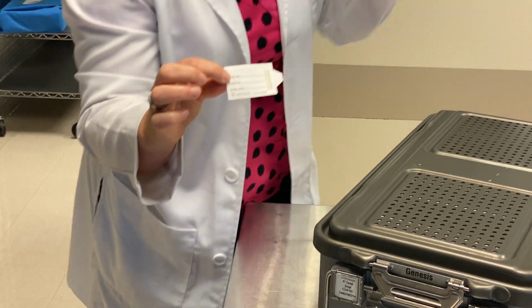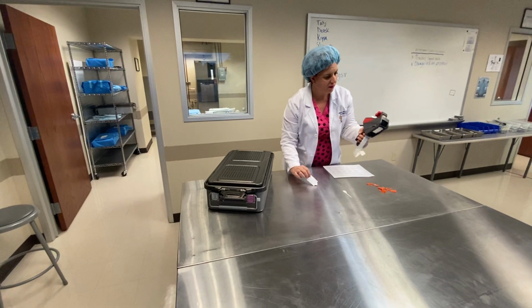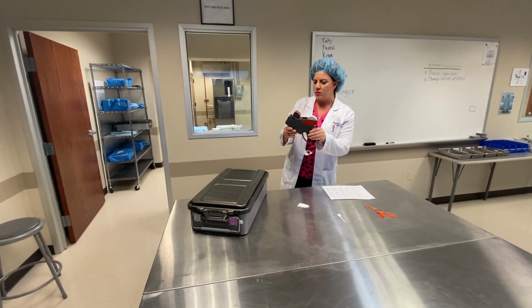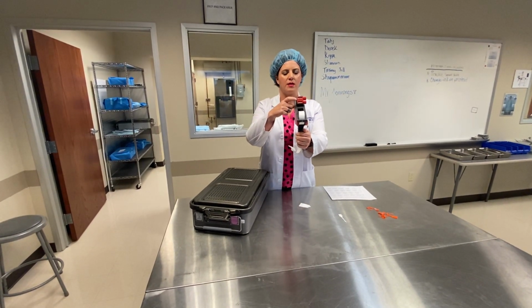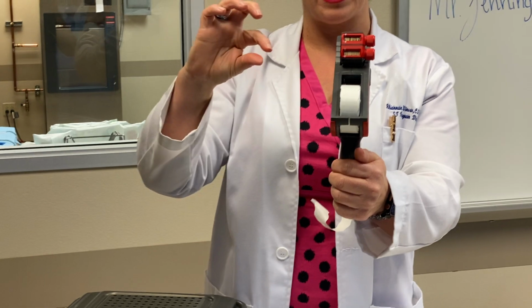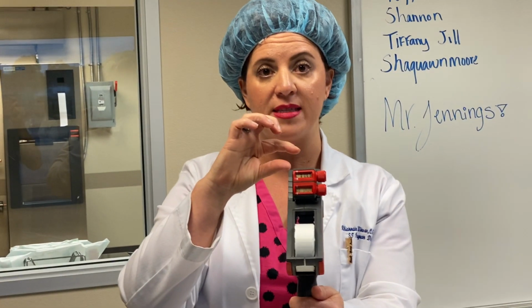This is typically where we put a special little sticker. And if you've seen, like you can sticker things like price tags and things, this is a similar gun to that they use in the prep and pack department. It has some little numbers here on the front. Those numbers will indicate which sterilizer it was sterilized in, which load is this for the day.